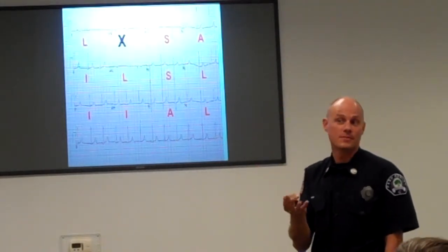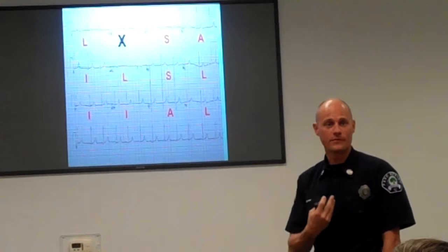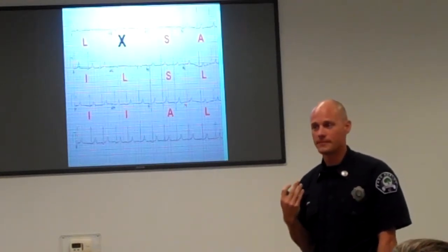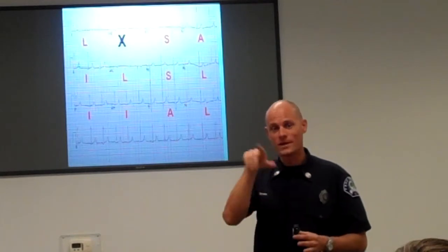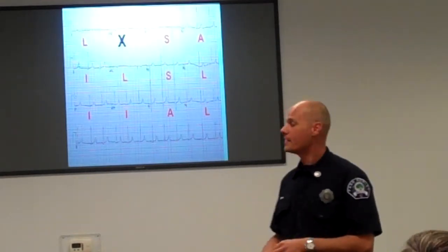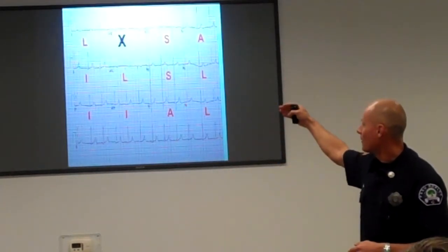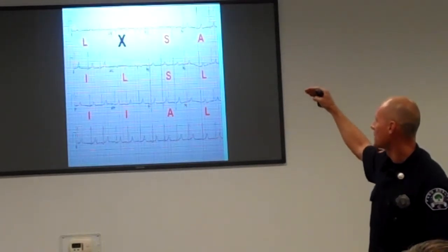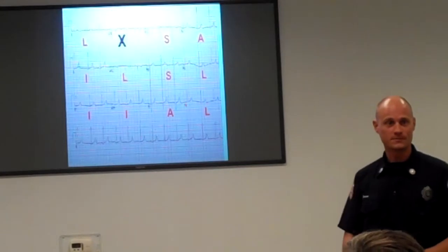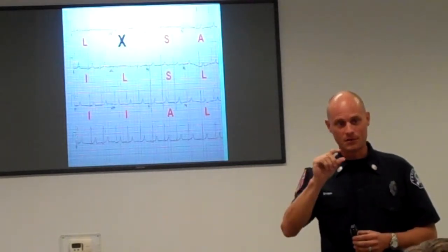Yeah, but it doesn't tell us much, right? Because of the location of the electrical pathway of the heart, AVR doesn't tell us much. So because AVR doesn't tell us much, we exit out, forget it, okay? So we drop below that to lateral, inferior, then we go septal, septal, anterior, anterior, lateral, lateral, okay? So big lie, little lie, say all.